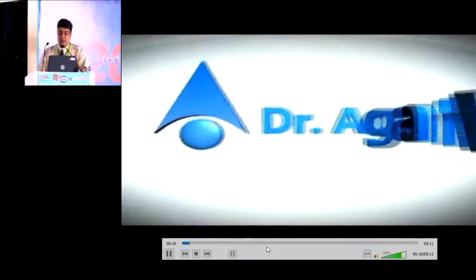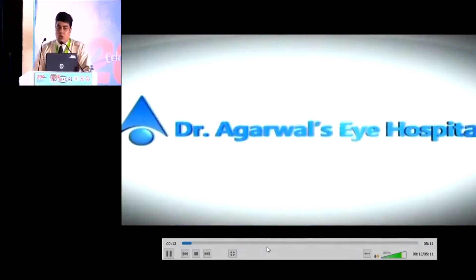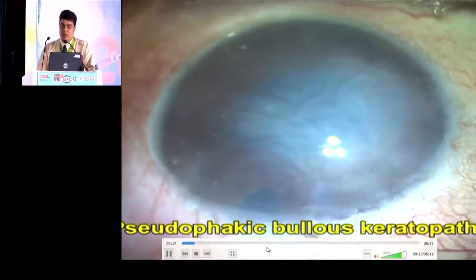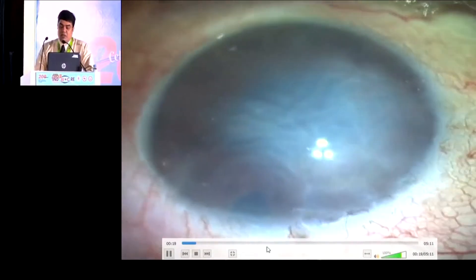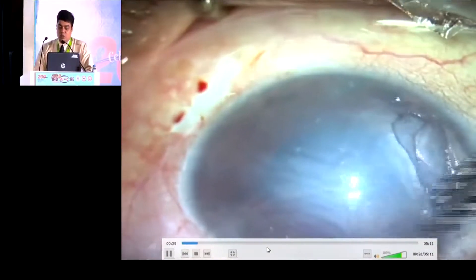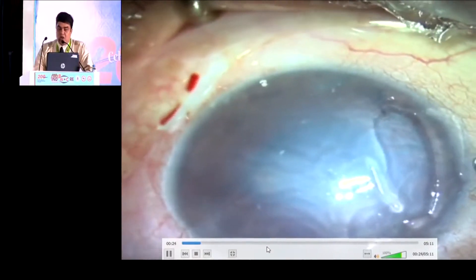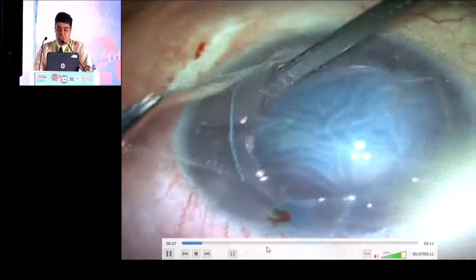Good morning everybody, respected judges, seniors and media friends. I am going to talk about a case which is referred by a top retina surgeon from Mahalakshmi, Mumbai. It's multiple times operated because of a nucleus drop, eye hole drop. You can see the decompensated cornea with a typical scar where the visualization is poor.